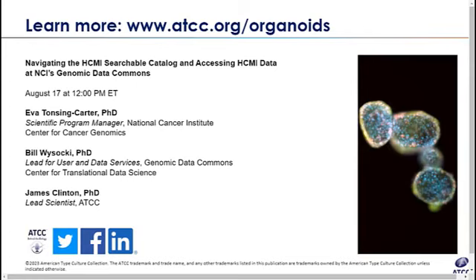In some cases, not all models need, for example, Wnt. So again, it comes down to you can do that, but then you are not following the guidance that we have provided, at least with our models. For other models out there, I'm not going to say one or the other. It would likely support growth if those are vital components as part of the culture.